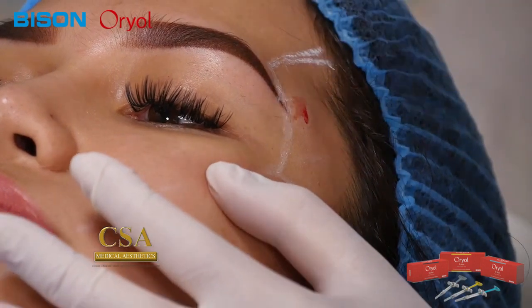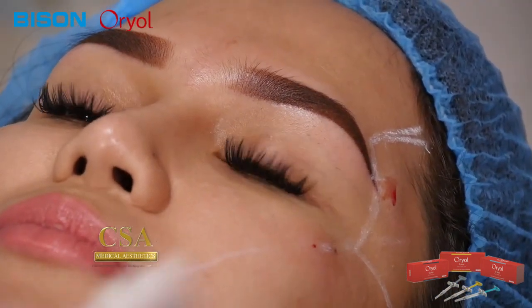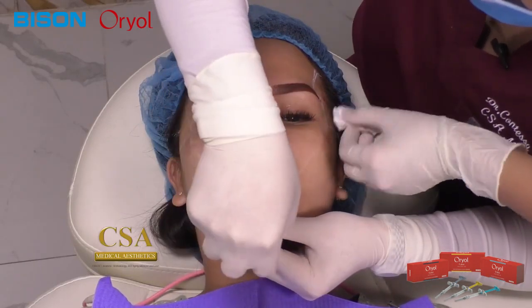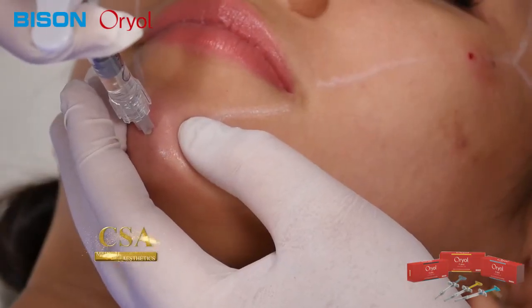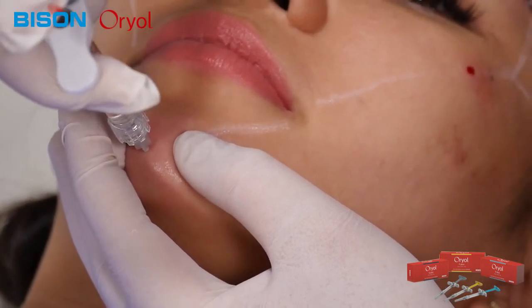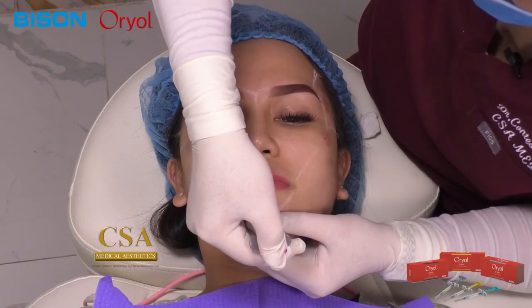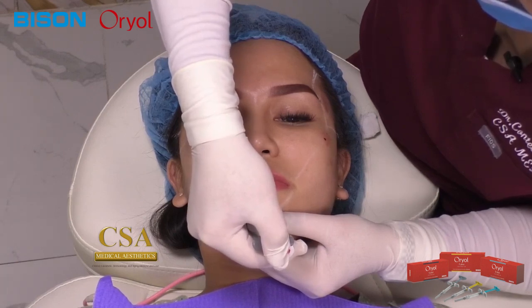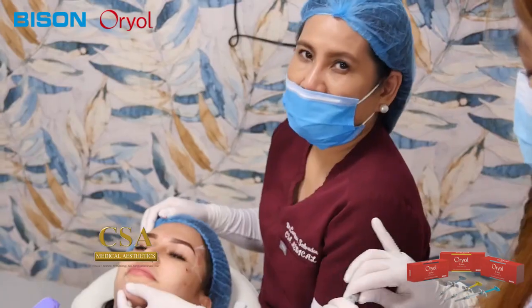So later on we'll do a balance check if one side will need more volume, because whenever we do assessment of the face, we notice asymmetry. One side can have more of a volume loss, one side can have less. So this is just adding a little bit more here, and we are done with the treatment. Almost about to finish here. Just a little bit more, and actually I am just using on this left side about 0.8 ml, and we'll check when we need to inject more on the right. And after this, we'll show the result to Kim.